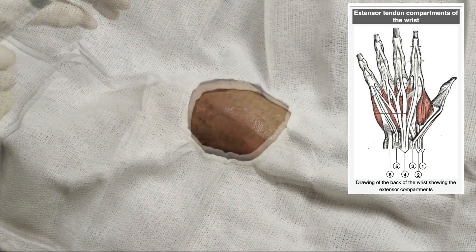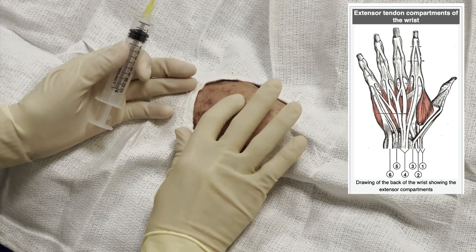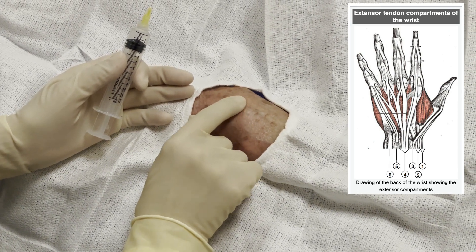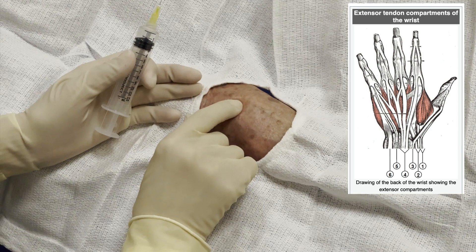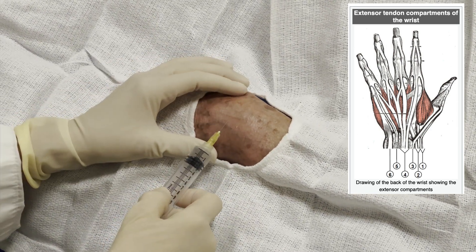I'm cleaning the wrist thoroughly with the Hibiclens. Then I palpate the wrist. It was very hot, very red and painful, and actually it was so easy to palpate the joint capsule. As you see I'm pressing down, I can just feel the joint capsule being very ballotable.